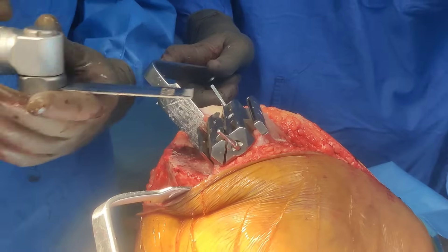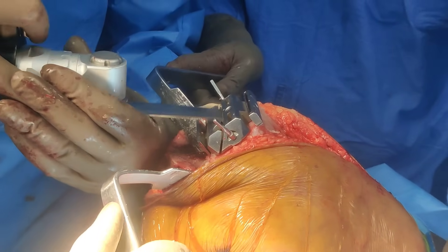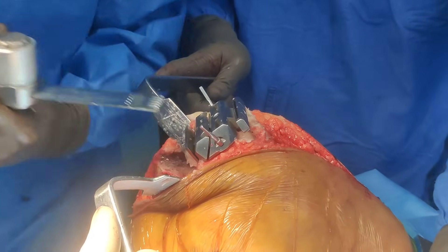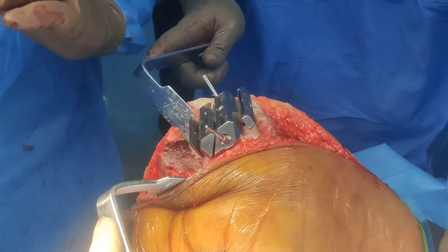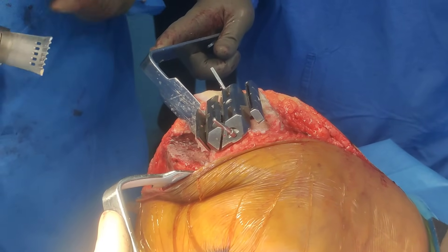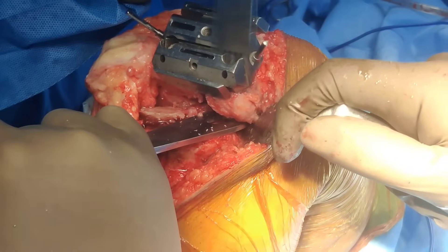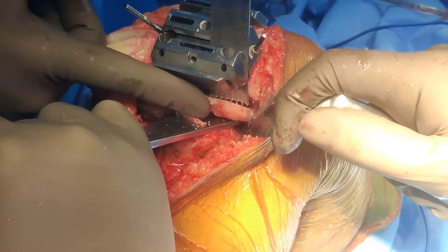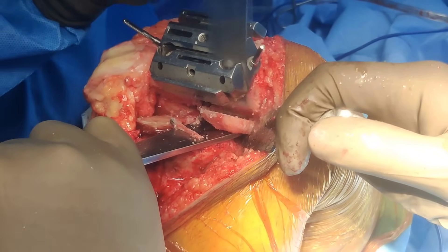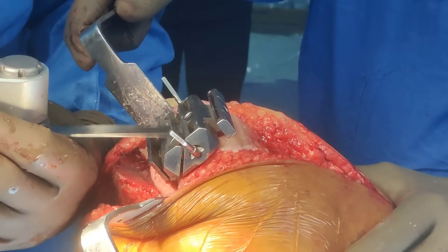Now we are cutting the chamfer cuts — again upside down for the same reason. If you bend, you take more bone, so full speed. Listen to the noise of the saw blade: a nice smooth sound is good; a struggling, rough noise means your blade is bent. That's the last chamfer cut — upside down. Once it starts to move that means you have done the cut. Even experienced surgeons can occasionally struggle — the noise tells you everything. This smaller, thin blade goes full speed straight up, no angle.